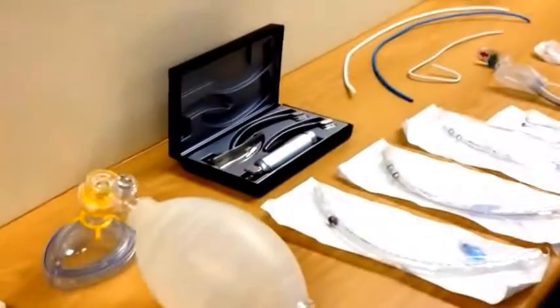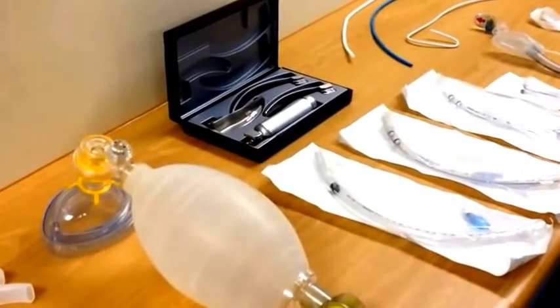In order to check our equipment, we will talk about checking the laryngoscope and checking the endotracheal tubes.